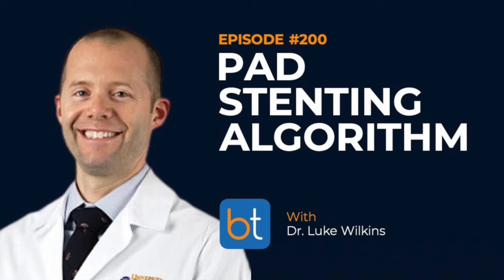I will consider an interwoven stent if the vessel is smaller or if there's a significant calcification. Some might say, what do you consider significant calcification, which is a very fair criticism. It's really hard to tell, as there's no good or agreed upon grading system for deciding what is heavy calcification and what is not. But given the radial strength of interwoven stents, I feel that more significantly calcified lesions do better with those stents. And if it's a particularly long lesion, then I will consider covered stents, self-expanding covered stents, in that situation. I see. Okay.